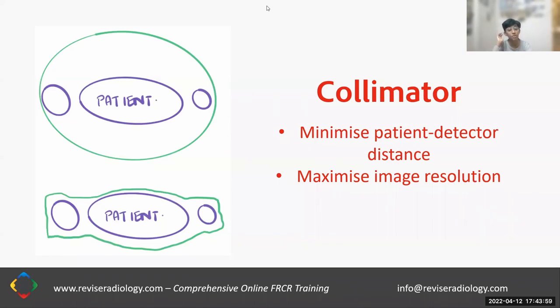So what will happen is that the projections at those views will pick up very few photons, and the overall image quality is going to be reduced. And the computer is also going to have a harder time stitching the projections together. This would be the easiest way for the cameras to travel, because we also know that the cameras have to travel in a very uniform way. But in order to maximize the image resolution, instead we make the detectors travel in such a way that the orbit of the detectors is tracing the contours of the patient's body.